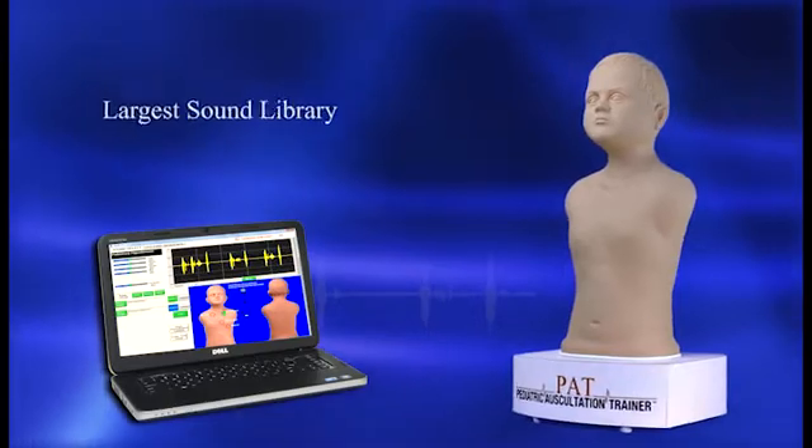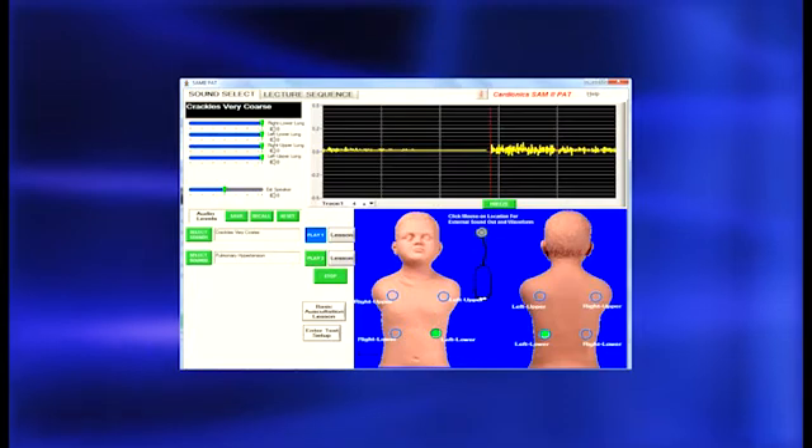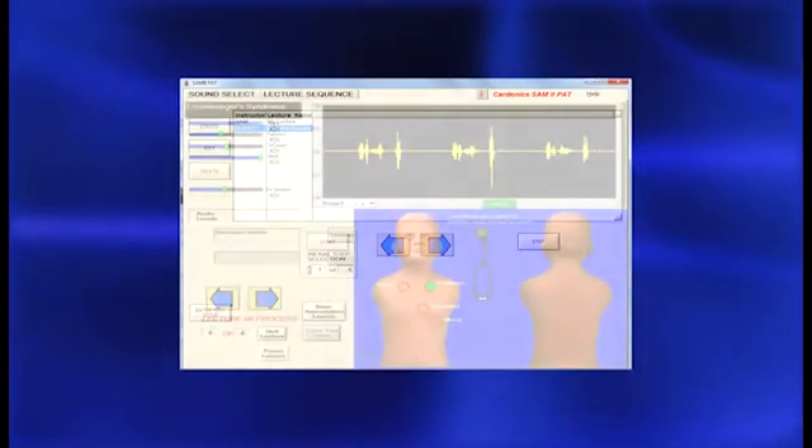With the largest sound library available in any pediatric auscultation trainer today, PAT includes phonocardiograms, sounds displayed at correct anatomical sites, programmable and password-protected lessons, and much more.